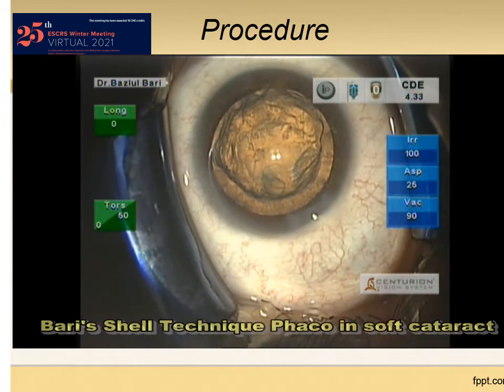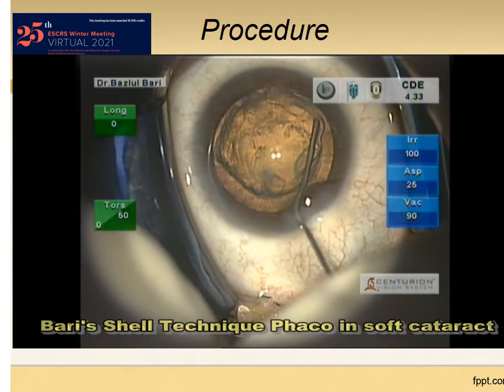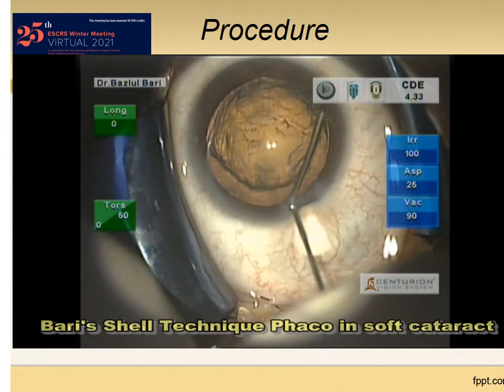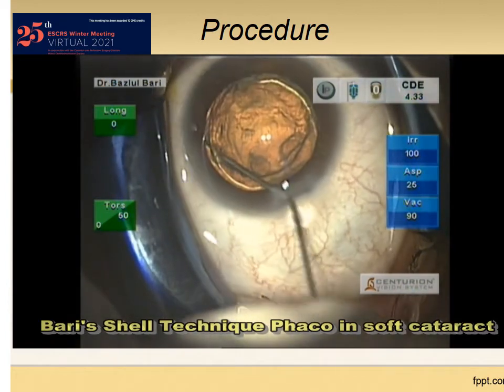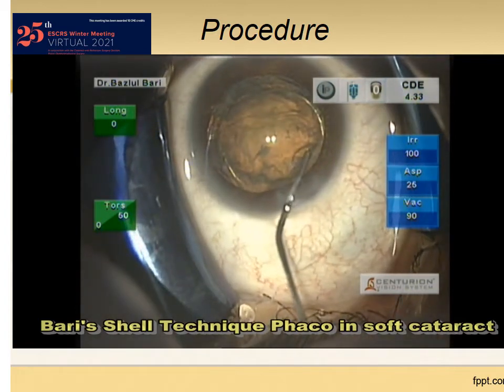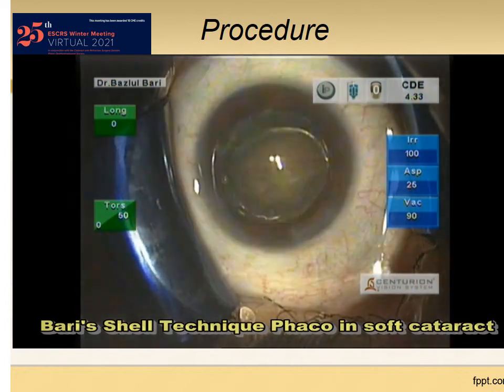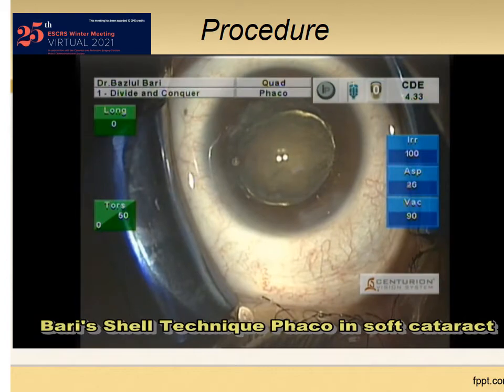This is the true hydro delineation. Now I am doing hydro delineation to create the shell below, then hydro dissection. The golden ring is seen, so it is done. There is popping up of the nucleus in the free space that we mentioned earlier. No need to rotate the nucleus or to reposition it.